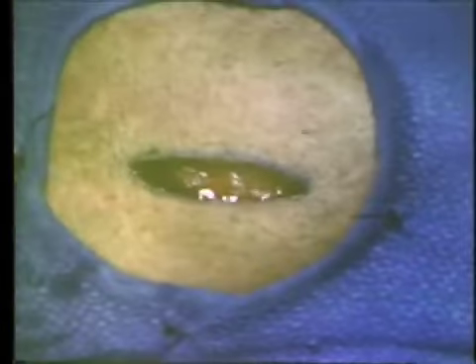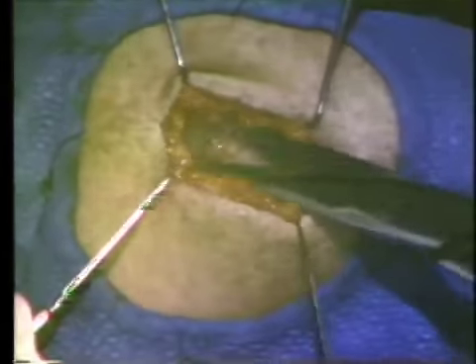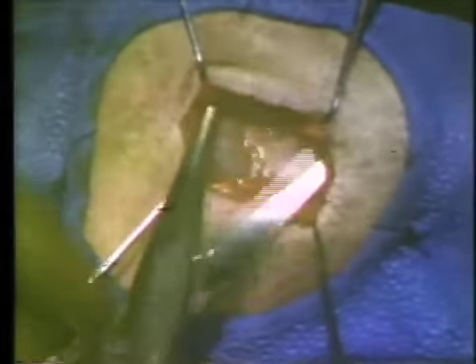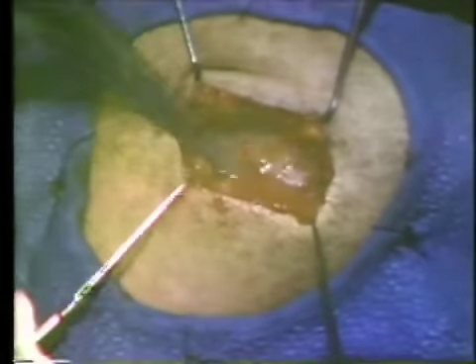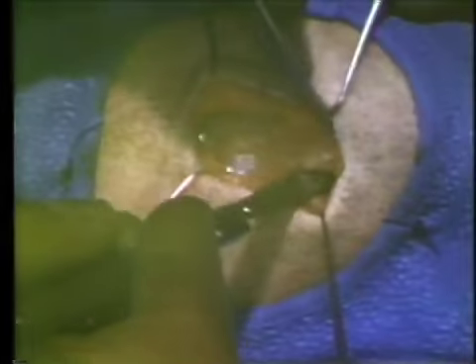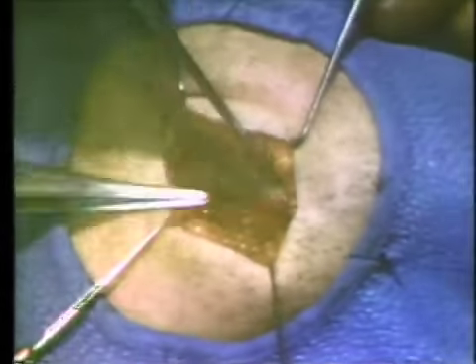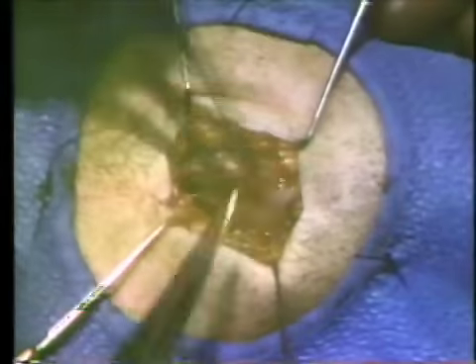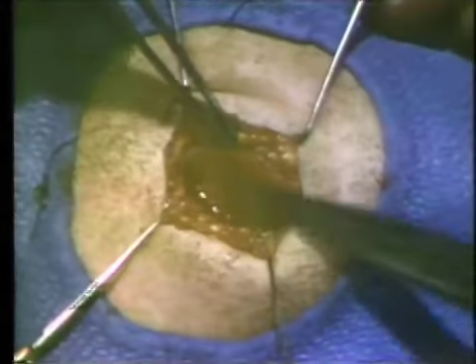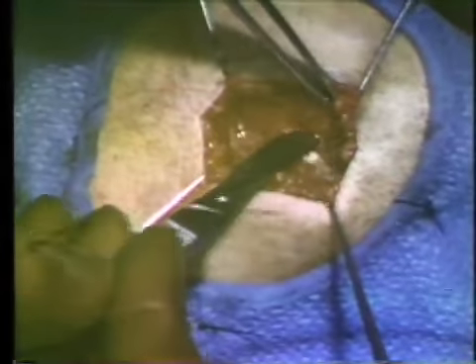Although this demonstration case is done under local anesthesia, it is indeed rare to perform this operation under local. It's possible, and when making movies and this going is slow, it's a little safer, perhaps, but by and large, most of the cases of osteotomy and ostectomy are done under general anesthesia with nasal endotracheal intubation.